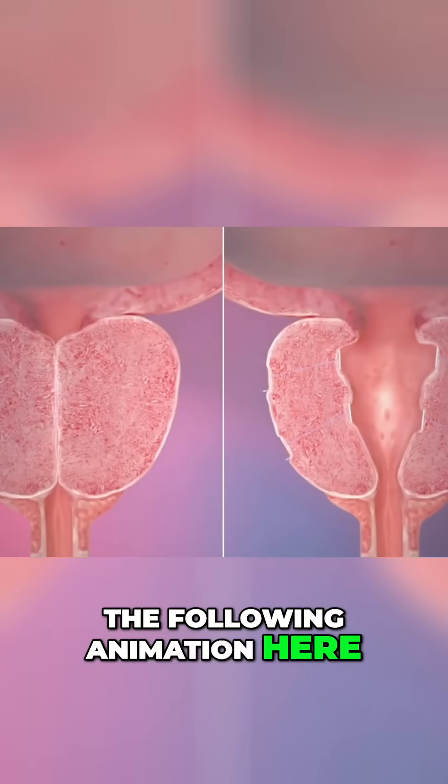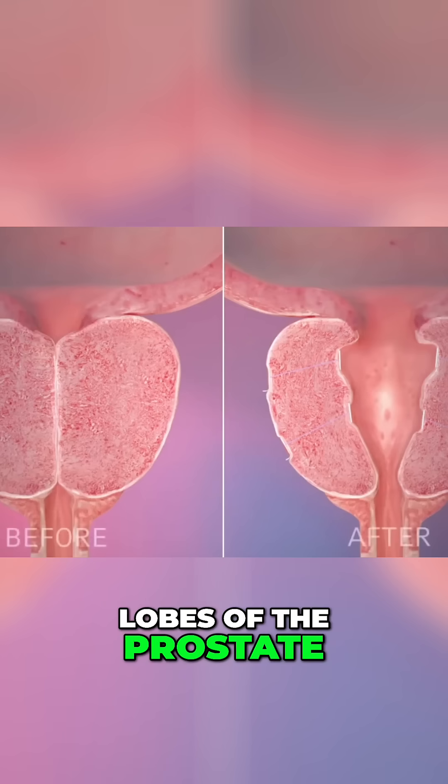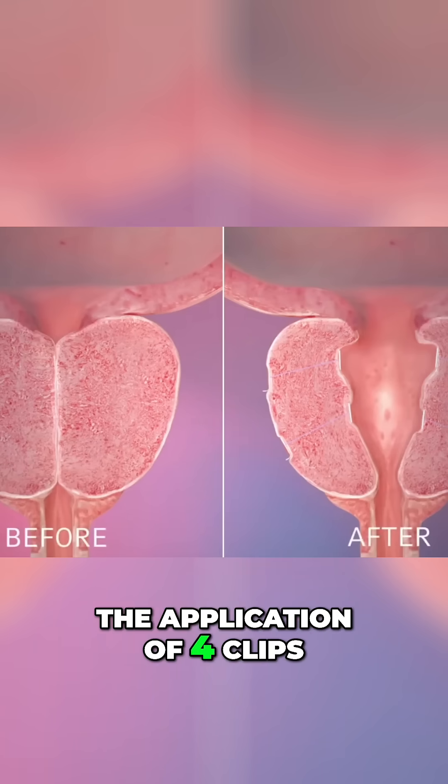The following animation highlights pre and post-op, showing how the lateral lobes of the prostate are successfully retracted with the application of four clips.